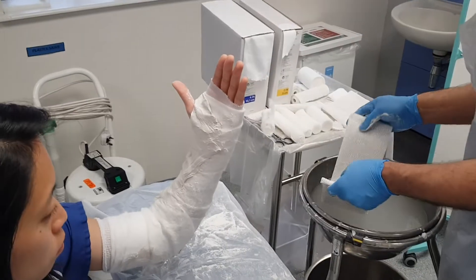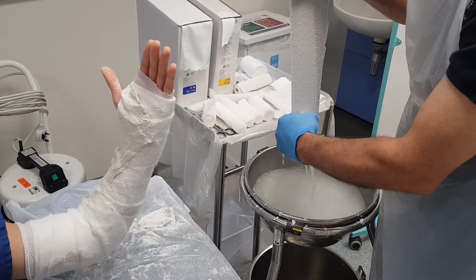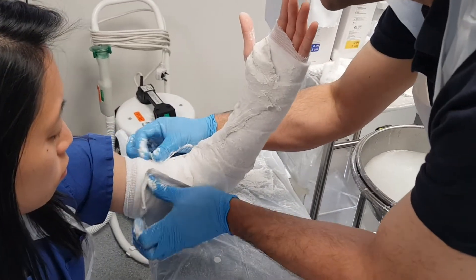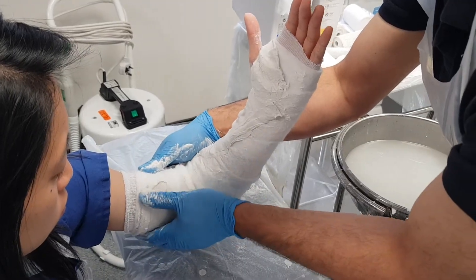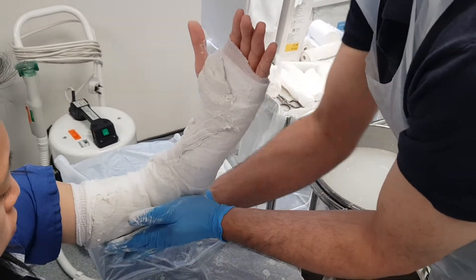I'm going to get the U-slab wet, squeeze out the excess water, and laminate it. That's going to provide my side support. I don't want it to go further than the wool. I'm just going to smooth it off with the palms of my hands.